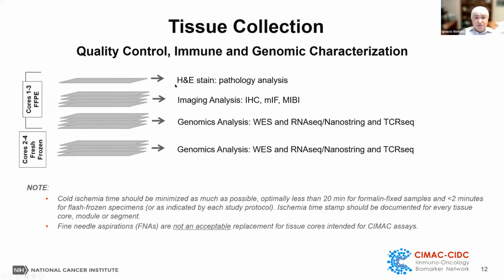It's important that we always need to have an H&E, a histology slide, for quality control. If not, imaging could also be useful. It's important, as I mentioned before, to control the quality of the tissue specimen before fixation or freezing. And here we have different notes that allow us to actually get specific information on this.